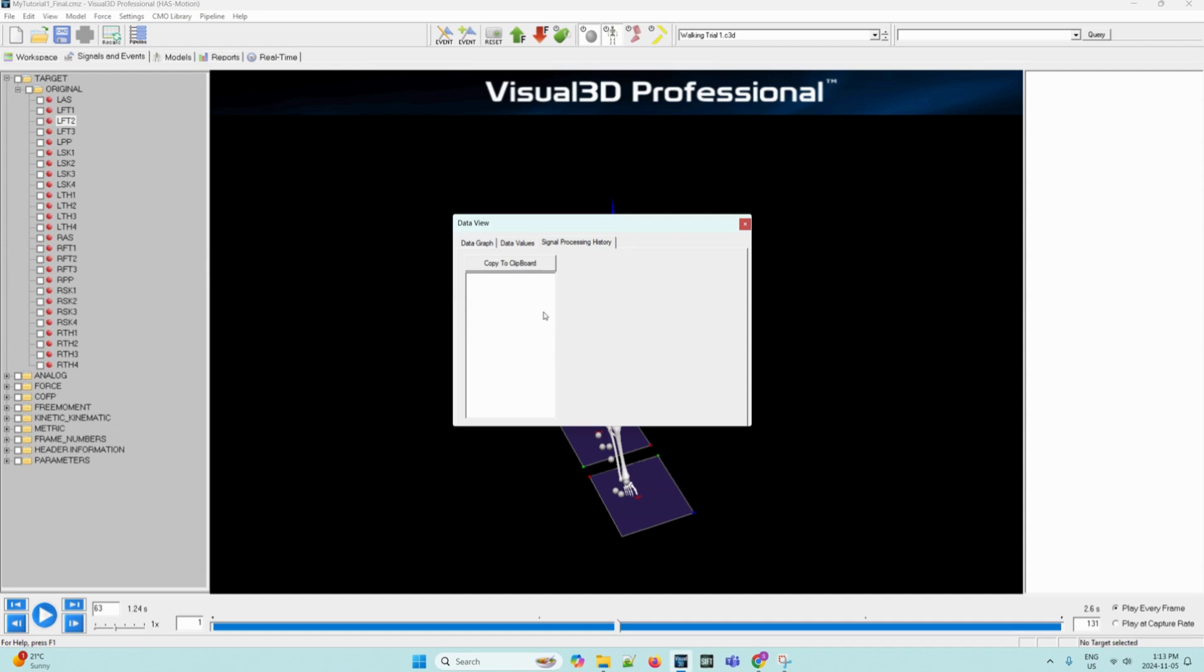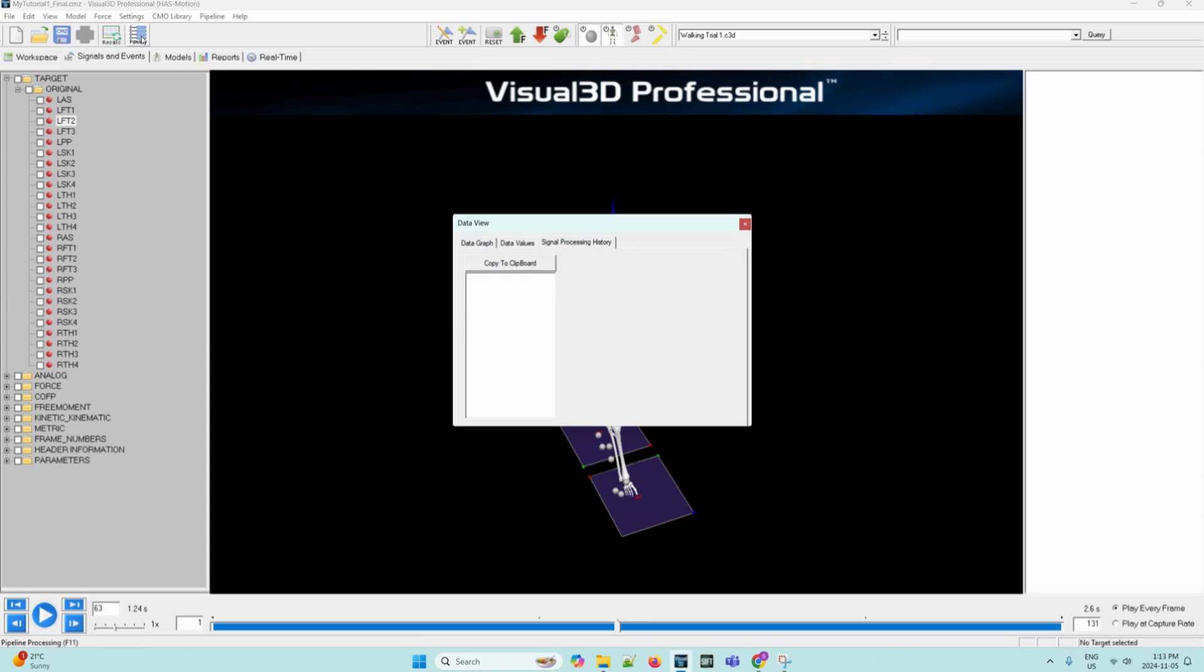Visual 3D has a command pipeline which allows users to prepare scripts for processing data. The pipeline can be found on this icon on the upper toolbar. Typically, these commands create new data that is derived or interpolated from the original data. Determining the distance between two points would be an example of such deriving data. The signal processing history tab will tell you what events, if any, took place on the data. As we can see here, since it's empty, there is no pipeline that has been ran on our data so far.